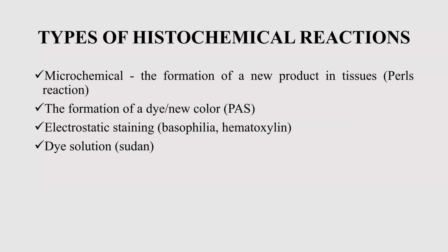We use this reaction for identification of iron ions in tissues. It's the result of some hemorrhage, etc. It can distinguish hemorrhage from melanoma, for example.